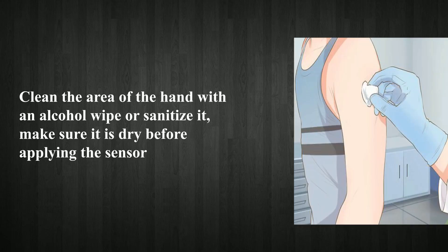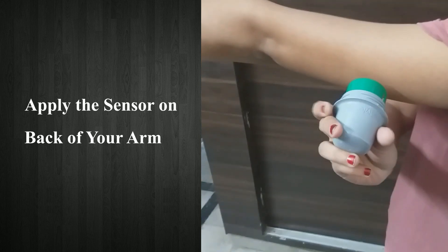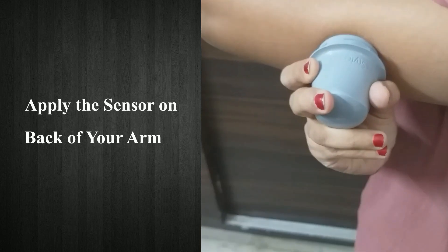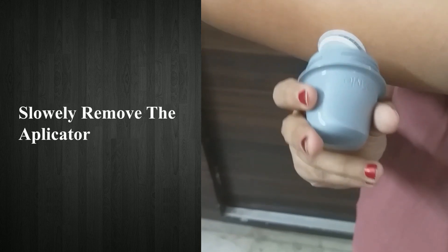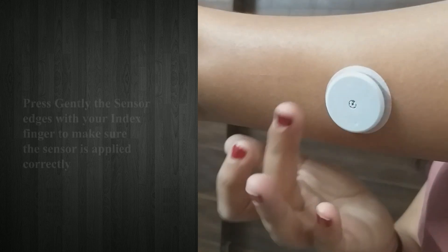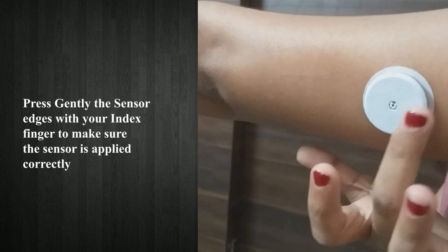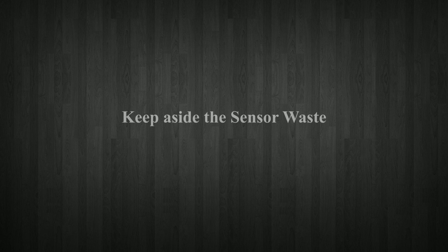Use alcohol wipes or sanitizer on cotton to clean that area. Apply the sensor on the back of your arm. Slowly remove the applicator. Apply pressure on the sensor edges with your index finger to make sure the sensor is applied correctly. Keep aside the sensor waste.